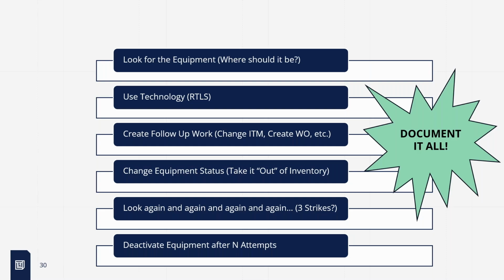I've seen the planner position or asset inventory lead technician, or lead somebody, that has the ability to add equipment. Where does that go through? What does your asset intake form look like? Can you default things, or have someone review that information prior to going into production? That's the main thing around standardization: it takes time. It takes more time to clean it up than to have fewer people do it.